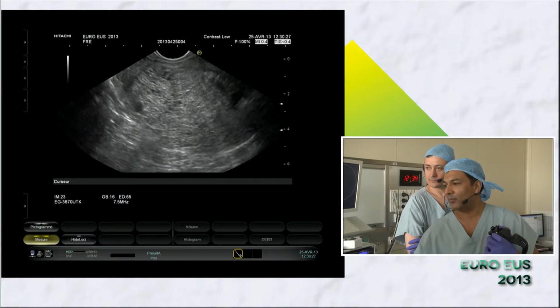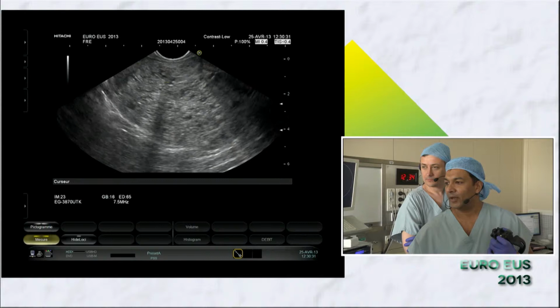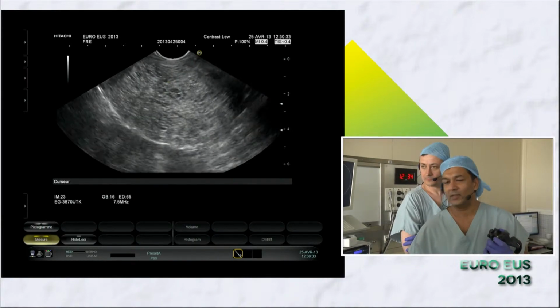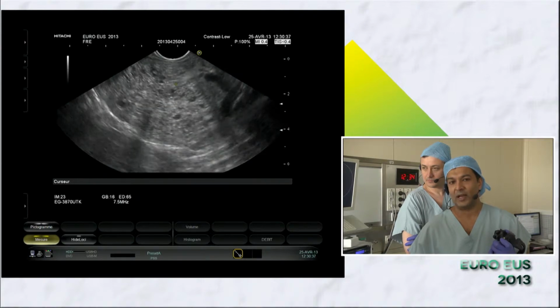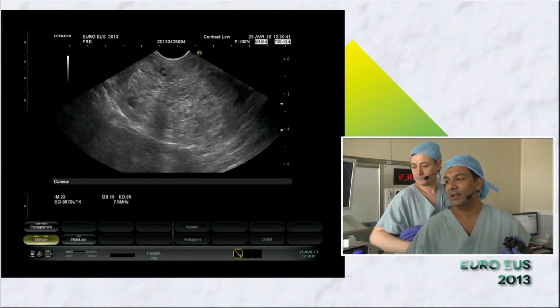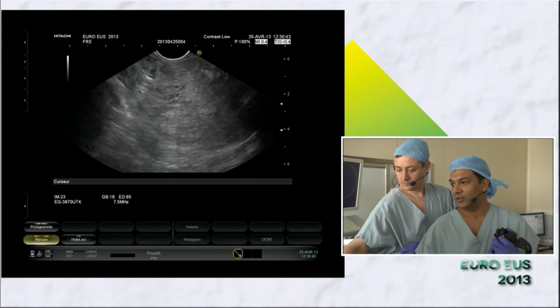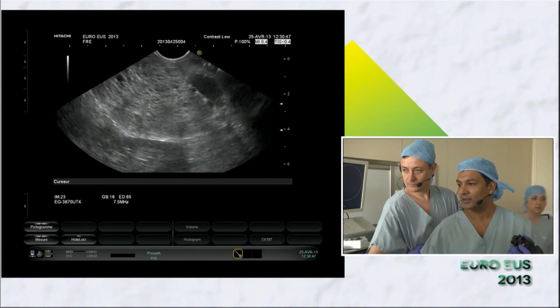Now, much to my surprise, here's this fairly well encapsulated microcystic tail lesion, which again doesn't look calcified, which looks like a typical microcystic adenoma. Typical. So it looks nothing like the liver lesion, which looked clearly solid. So we're going to do some contrast.